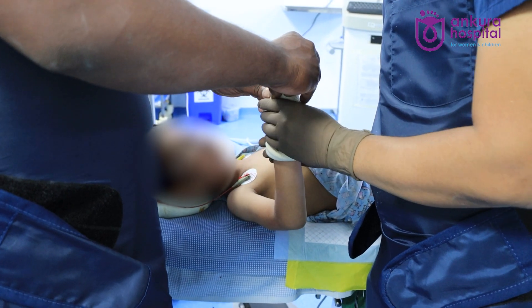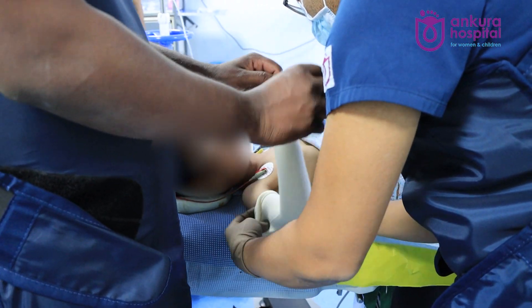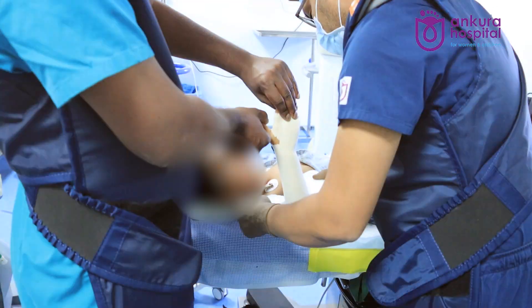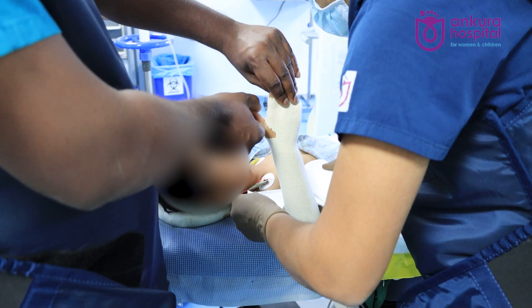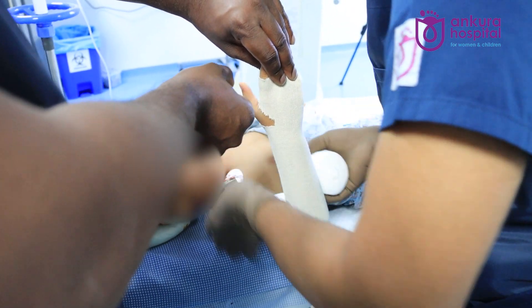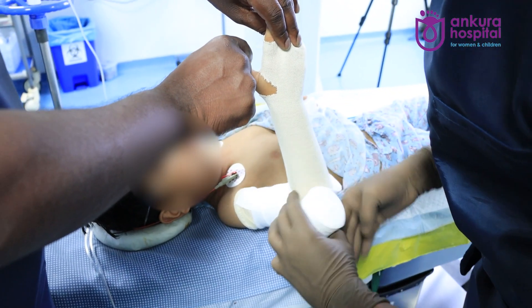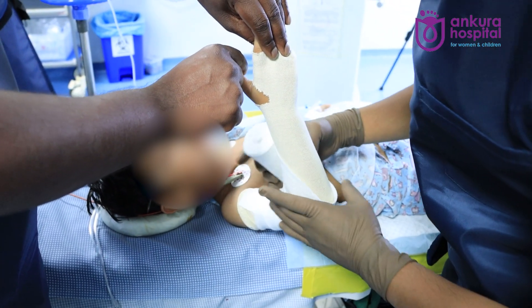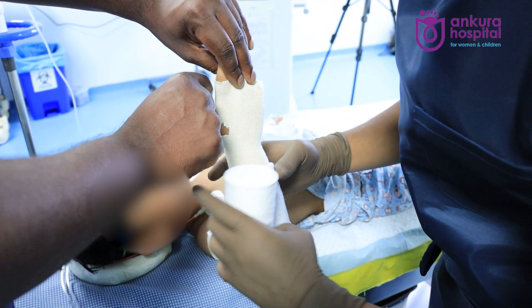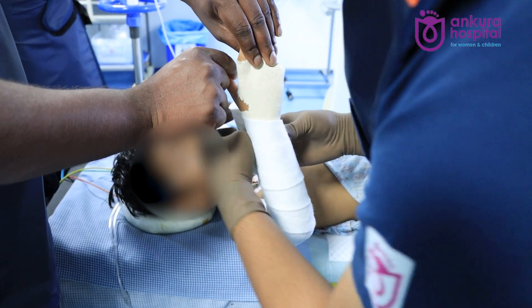Now comes the second part — applying a good cast with a good cast index. The padding should not be too much; just a single layer of padding to get a good cast index. We need to have a good padding index as well — it's a very thin layer of padding, otherwise the fracture might slip inside the cast once the swelling subsides.